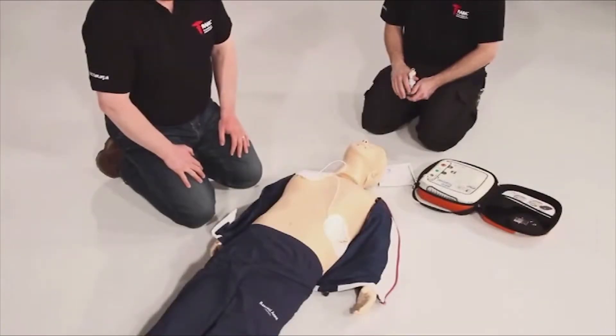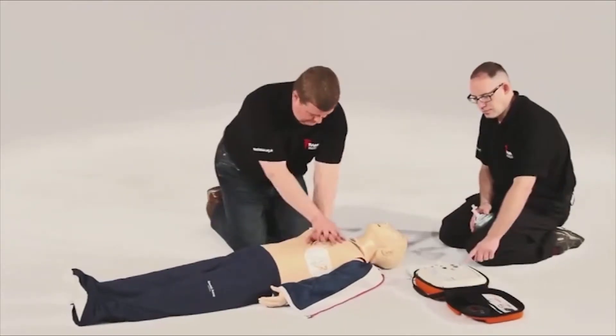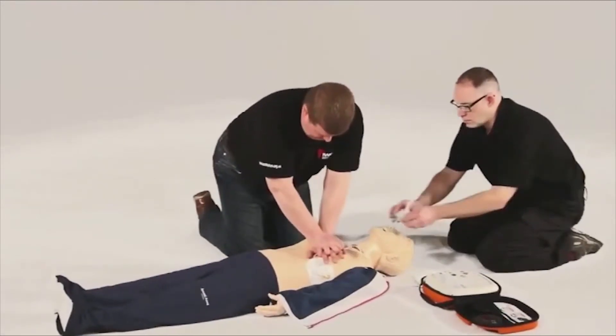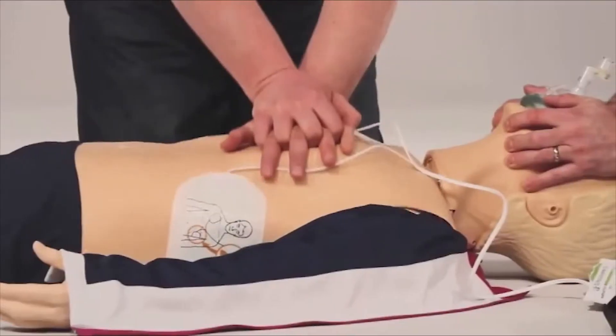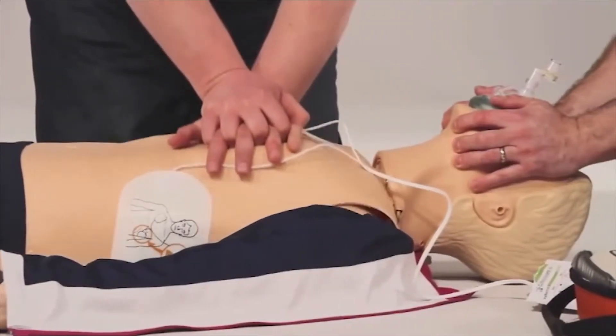At times, a patient's heart may not require a shock. In this instance, the AED will state "No shock advised. Begin CPR now." In these circumstances, it is impossible to accidentally administer a shock. If the patient is showing no signs of life, you should immediately start CPR.